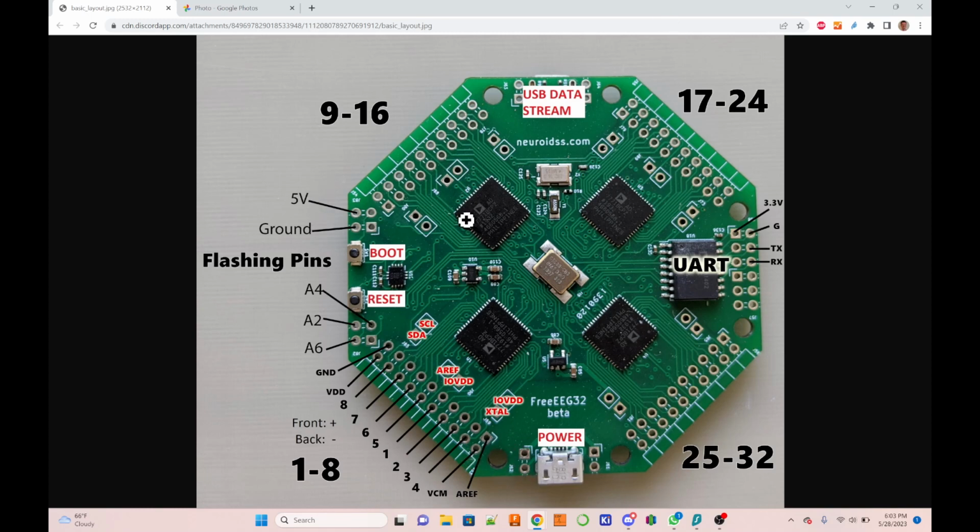internally on the board. In fact, if you look closely on your board, you may even see the wire that goes around the trace. So if you connect one of them, you don't have to connect the other ones on your headset. Just one of these VCM pins on your headset is enough. Of course, it is nice to just do them all four, but it's really not necessary.